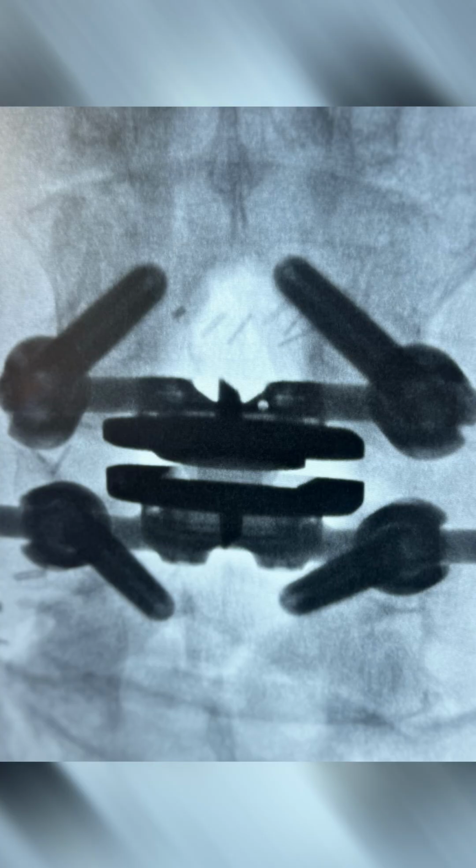We went to several meetings, we talked about this, and there are other technologies that have been used to look at anterior in the front and posterior in the back, supportive mechanisms for motion preservation. And I said, well, heck, if one of the reasons why you cannot get an artificial facet is because the disc is not adequate, why don't we replace the disc? And if one of the reasons you cannot get an artificial disc is because we're worried about posterior facet disease, why don't we replace the facets? And so it seems logical, right?